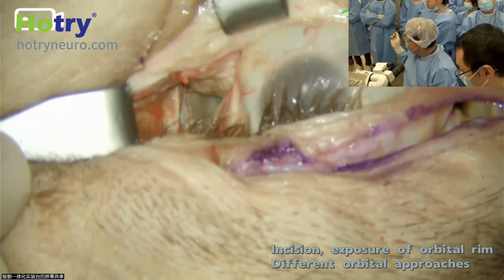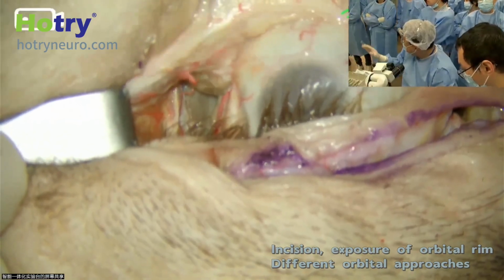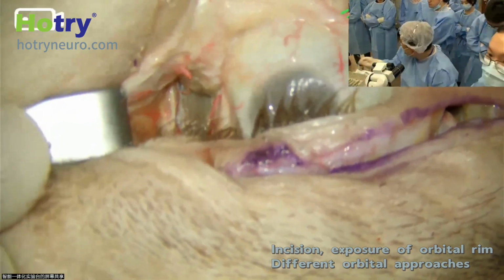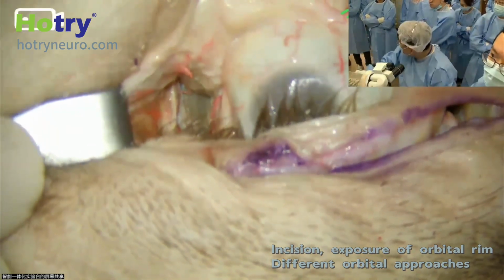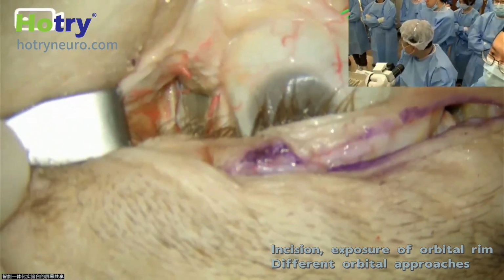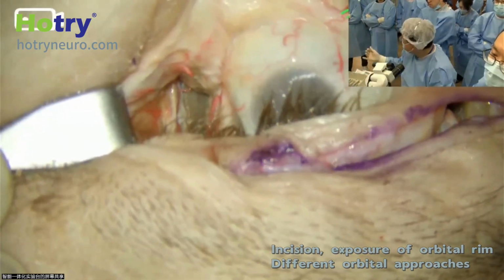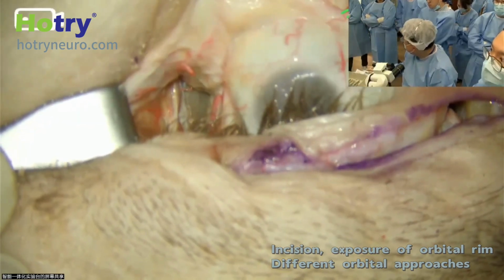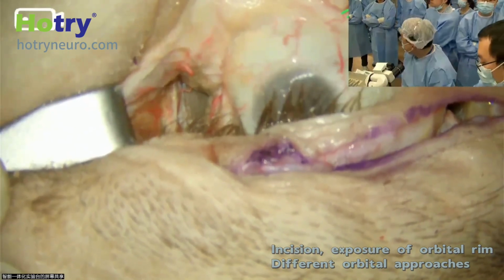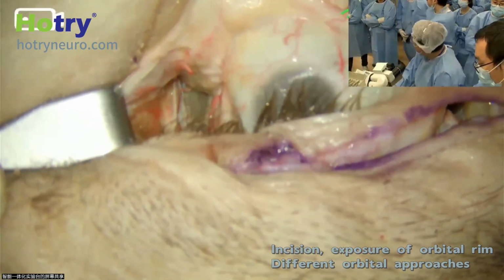So now when we work with Kelvin, after we make the periosteal incision or periocular incision, we find the anterior aspect of the mass. For those very sticky ones, we put the endoscope in and use endoscopic guided dissection. Yesterday, we saw the ophthalmic artery and the cranial nerves, and once we can see that, it's much easier for us to preserve all these important structures, leading to a better outcome. So that's all I want to say. Are there any questions for me?